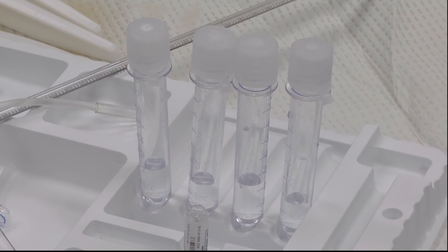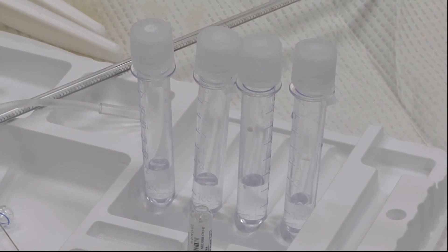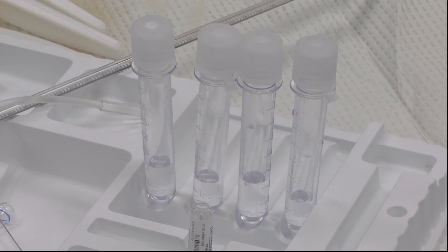Once again, just to review, there are four test tubes of cerebrospinal fluid usually collected. Numbers one and four go for cell counts. Number two is for chemistry, such as glucose and protein. And number three is for bacteriology, for cultures and sensitivities.